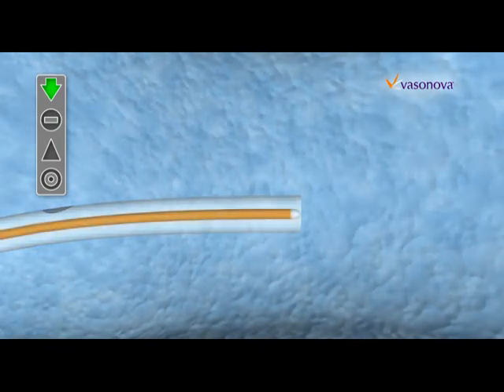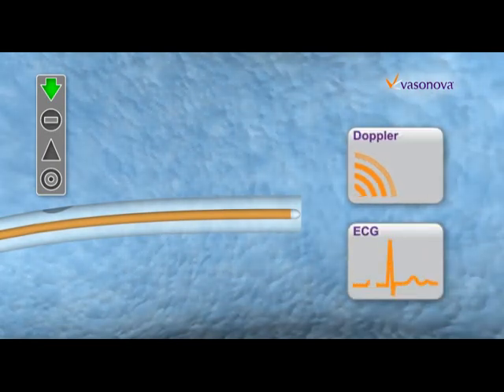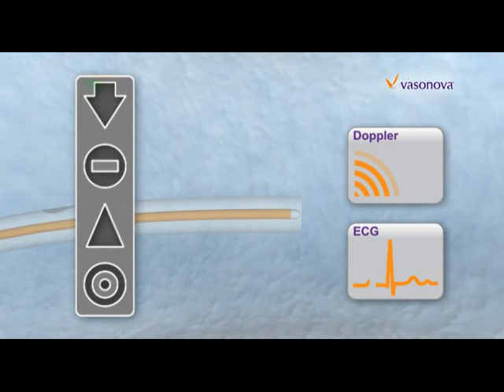The stylet captures and measures real-time internal physiological parameters. The data is transmitted to a console where visual indicators guide the clinician as the catheter is advanced through the vasculature.